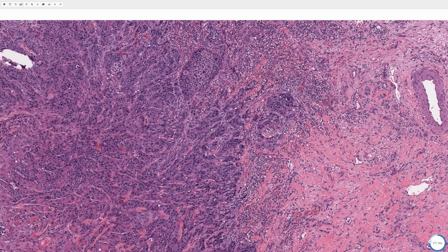But sometimes as these tumors become less well differentiated in a metastasis, they may not label well because, as they are not visually well differentiated, their immunohistochemistry may become less well differentiated. So sometimes they'll lose some of the markers, but typically a pancytokeratin is a good way to start.